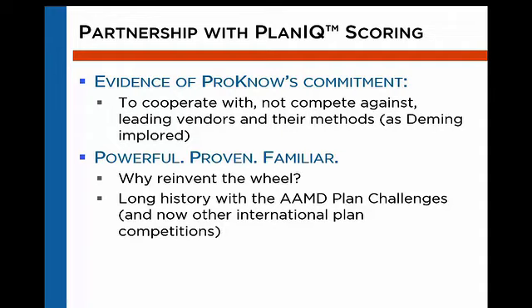So when we thought about how we want to score plans, of course our first thought was we want to keep what's working, and what is working was the scoring that we've been doing since 2011, so the last 5 years. Why reinvent the wheel? It's been a long history of scoring with this type of methodology. Everyone's familiar with it, so we definitely want to keep that. So without further ado, let's do a quick demonstration of how you sign up and participate in a plan study.